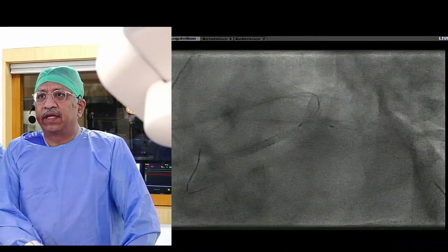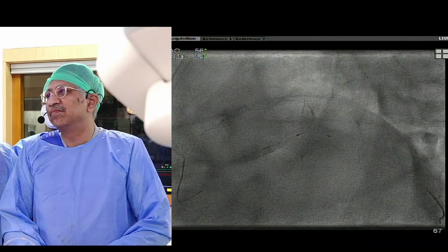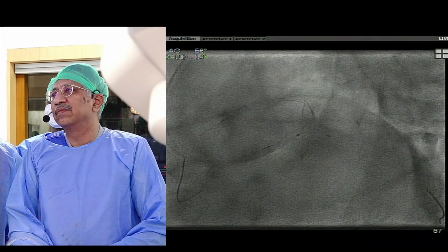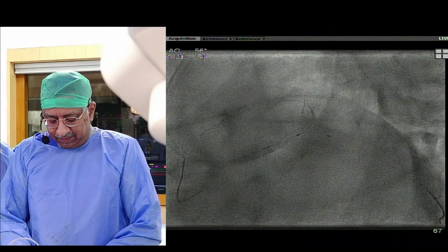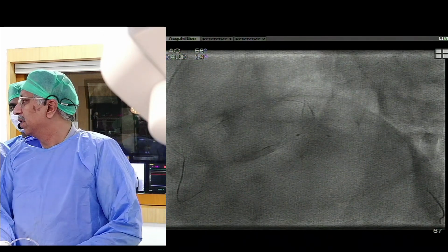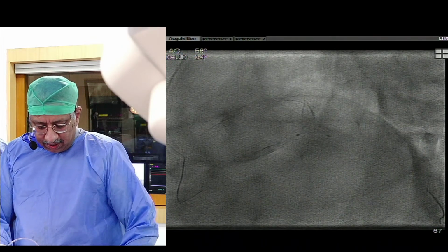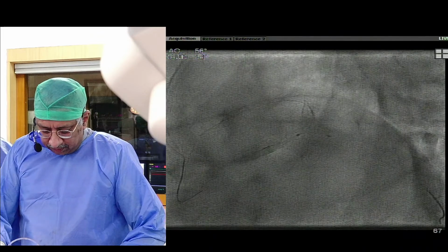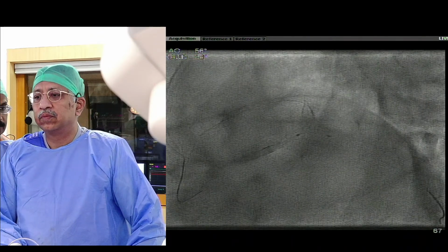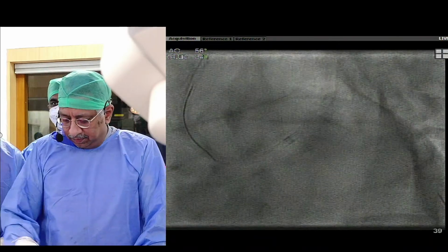This is honestly one of the most exciting areas of imaging guided PCI that I've seen. I'm delighted that you guys are going to be able to see it. It's OCT guided deferral of stent in STEMI patients, with calcified nodule. At his core lab, he does some amazing work. I had the chance to visit him. Ajit, thank you so much for joining us. Talk to us about your deferral program and how you're changing the game.